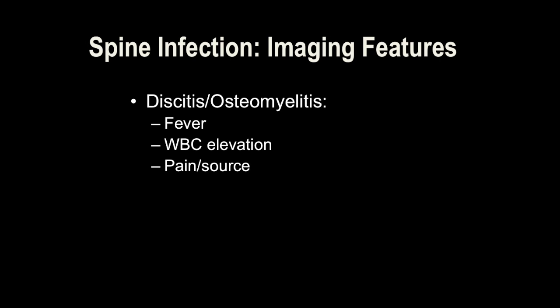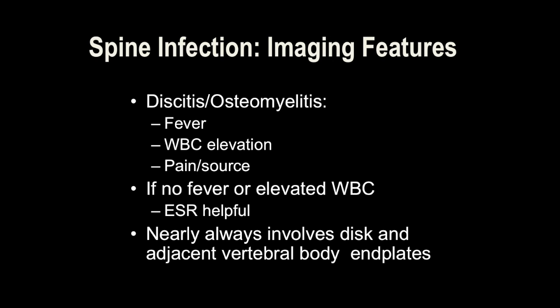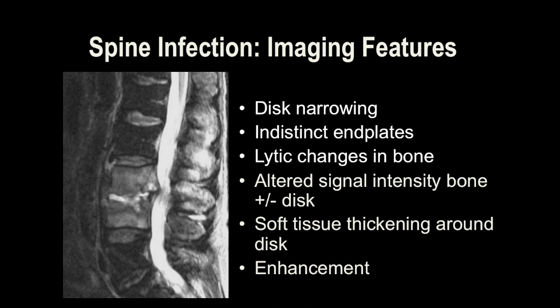Spinal infection is one of the reasons to perform MRI with and without contrast. We look for the diskitis-osteomyelitis complex, along with fever, elevated white count, and pain. ESR is often helpful. On T2 weighted imaging you have increased edema and fluid involving two contiguous levels of the lumbar spine.